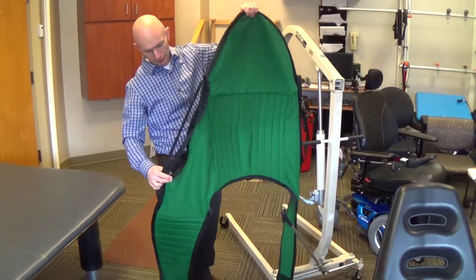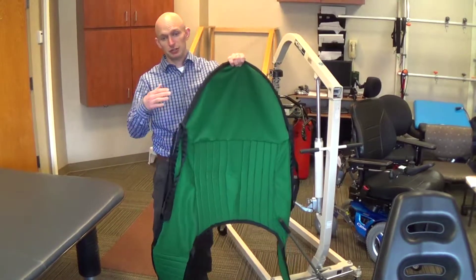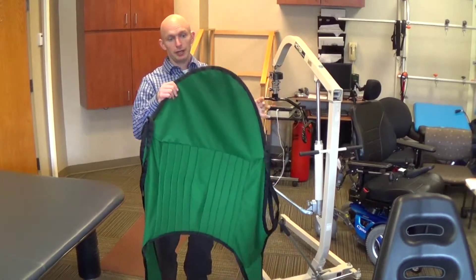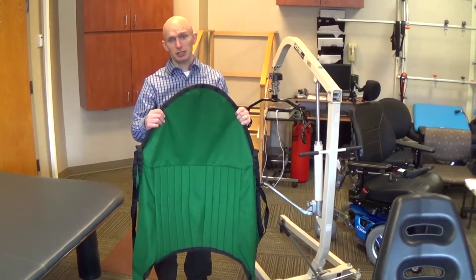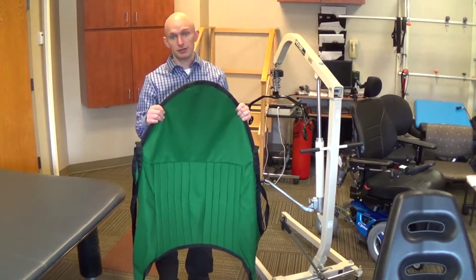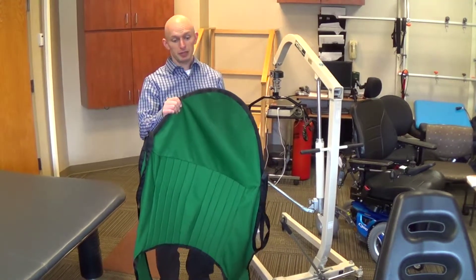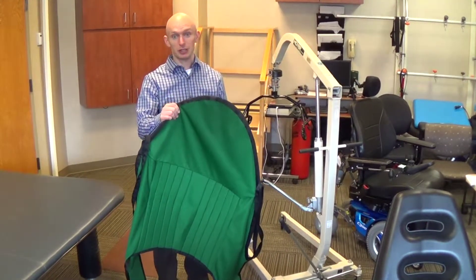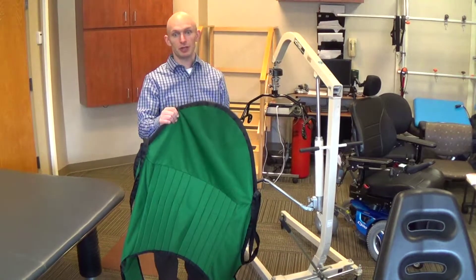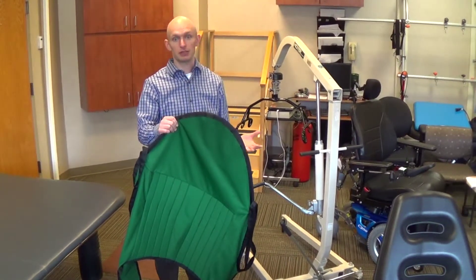The sling also has divided leg loops. This is essential to being able to place this sling in and remove it while someone is sitting in a wheelchair. This is very important so the person is not sitting on a sling all day long, which defeats the purpose of any kind of pressure-relieving cushion they would be sitting on.